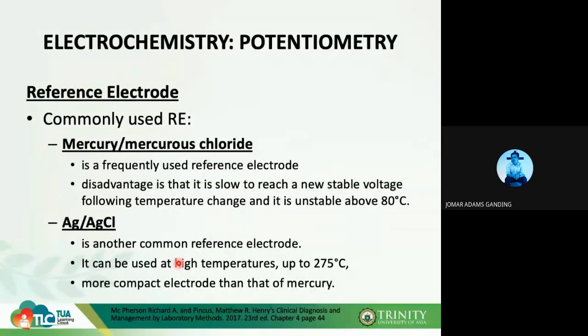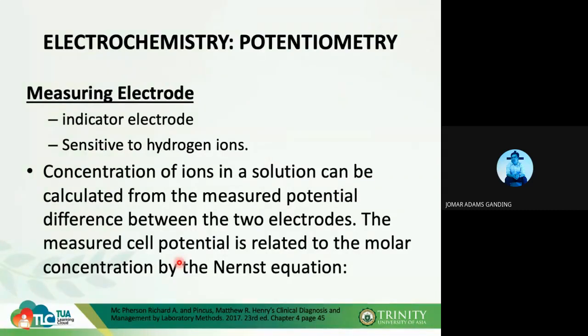Okay, let's move forward. We have your reference electrode. Now we have your measuring electrode, also known as your indicator electrode, also known as your analytical electrode. Okay? Analytical electrode. Sir, pag sinagot ko ba indicator? Sinagot ko analytical? Sinagot ko measuring? Yes, kahit anong isagot mo, kapatid, tama yan.